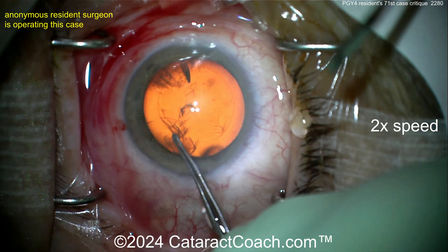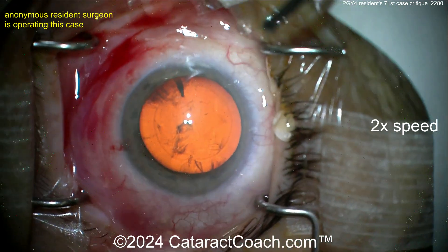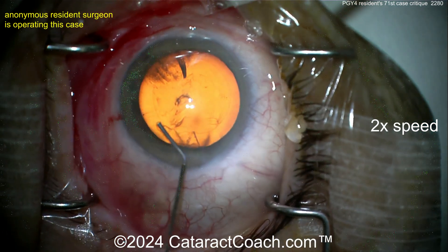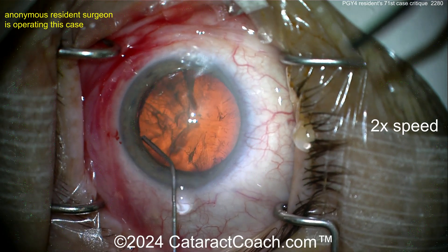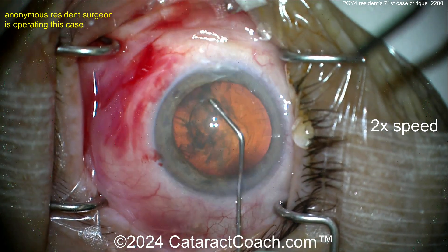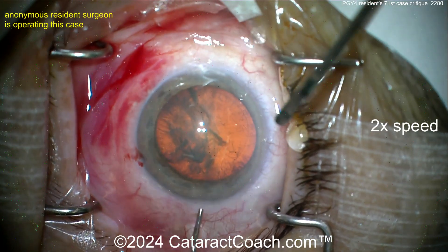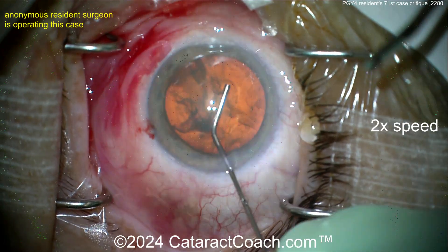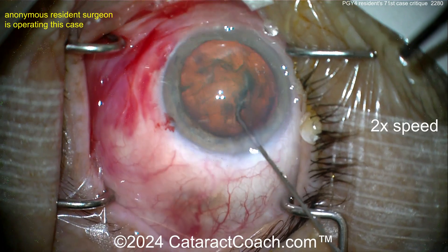We'll see when the IOL goes in the bag, but rhexis is complete — it's round, good pivoting technique, reasonably centered. Now hydrodissection: there's the fluid wave, and another one going across — very nice. Remember: if it does not spin, you will not win. Inject more BSS and get that nucleus spinning — it'll make your life a lot easier.